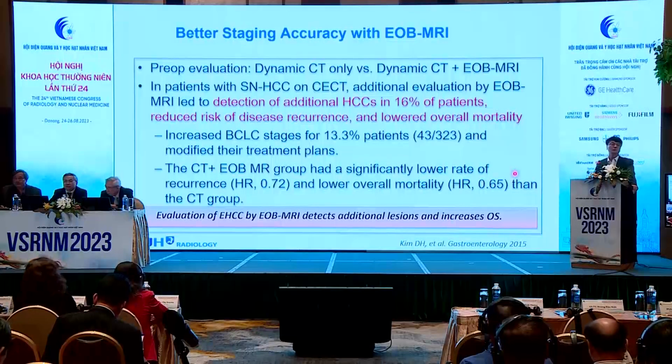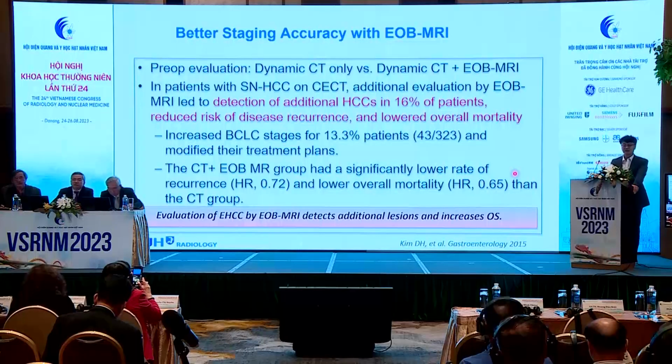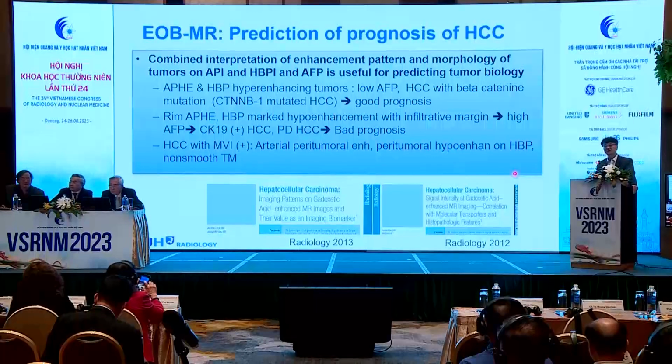And also with the EOB-MR, BCLC stage upgrade happened in 13%. That means treatment option should have changed according to that information. That's the reason why the patient group have better survival.